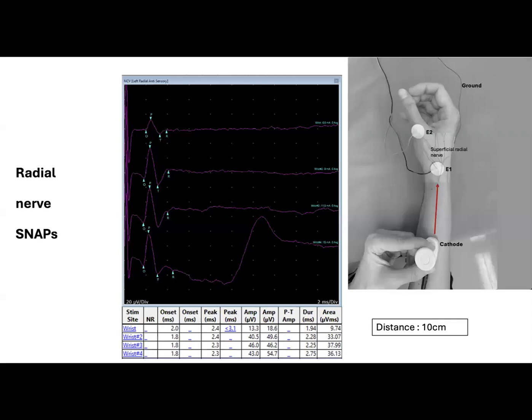To begin with, I will give you some examples of antidromic sensory nerve action potentials where we occasionally struggle to make good recordings, either because of limb movement or motor artifacts caused by volume-conducted motor responses. This is an antidromic superficial radial nerve conduction study. I find that positioning the hand between pronation and supination is a good way to maintain stillness and to minimize motor artifacts, instead of choosing either the entirely pronated or supinated positions.